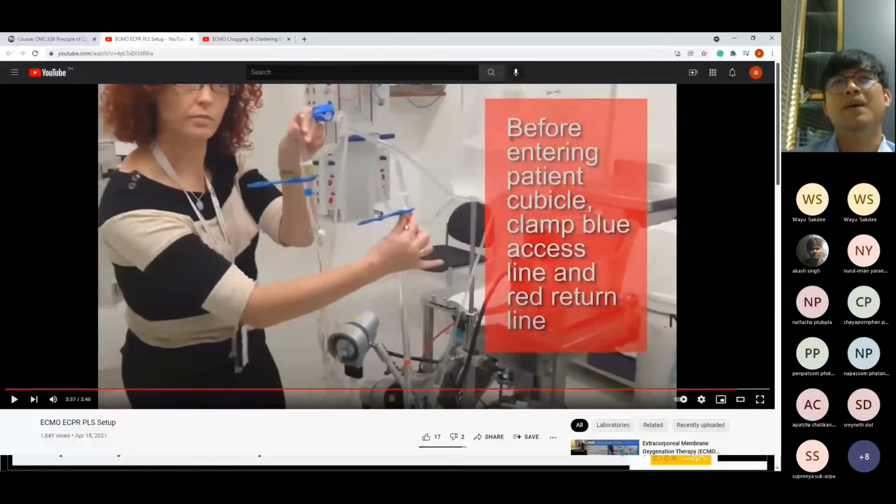Okay, you can see this one is going to be the return line, and this one would be the access line, connected with the access line.